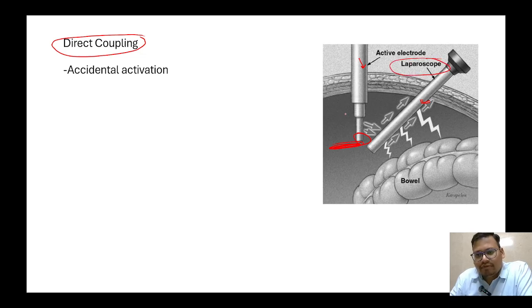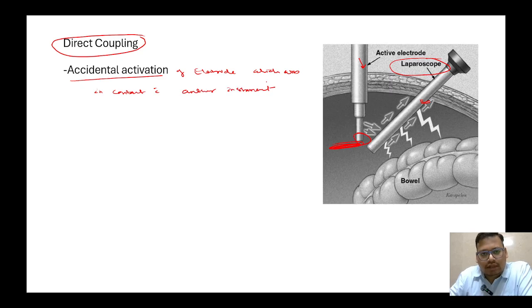Sometimes, unintentionally, there is accidental activation of the electrode, which is in contact with another instrument, that leads to conduction of current to the bowel.